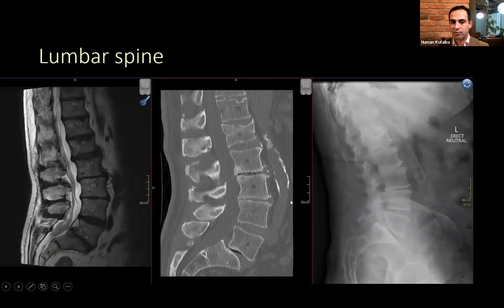We have the X-rays, we have the CT in the middle, we have an MRI again. And again, the X-rays will show your alignment and vertebral body height. We already have a minor wedge compression fracture at L1, which is evident on the X-ray, evident on CT and on the MRI. This patient also has malalignment in that the L5 vertebra, you can see it on the X-ray, is anteriorly slipped. There's anterolisthesis on the S1 vertebra. And that can be seen on the X-ray. So that gives us good information on that, as well as on CT and on the MRI.